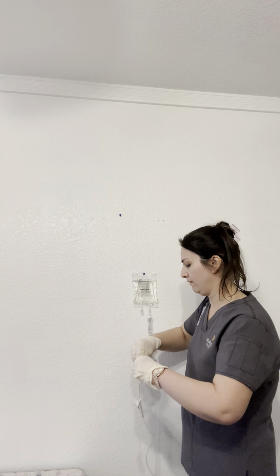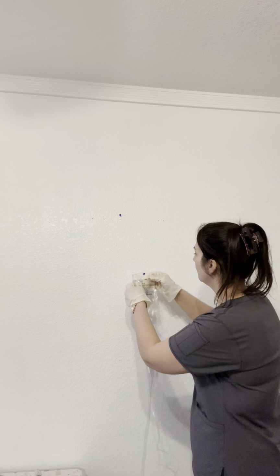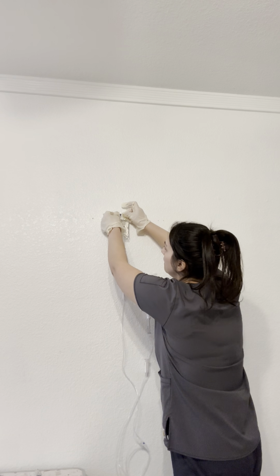All is twisted. We're going to put that one above because the patient needs their amoxicillin.